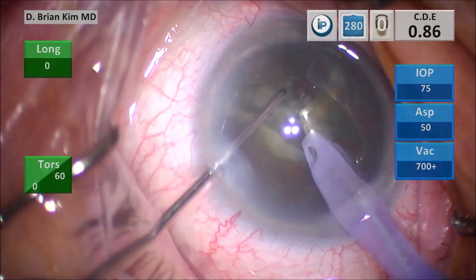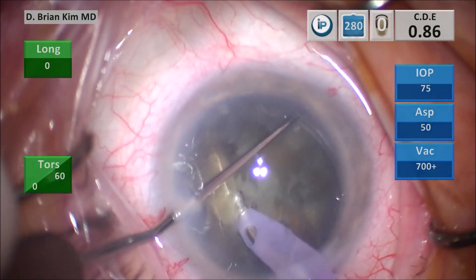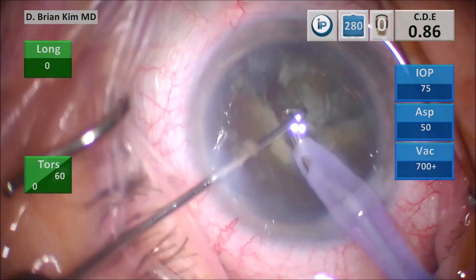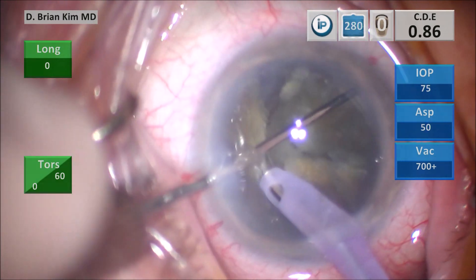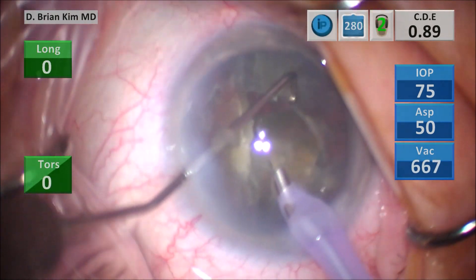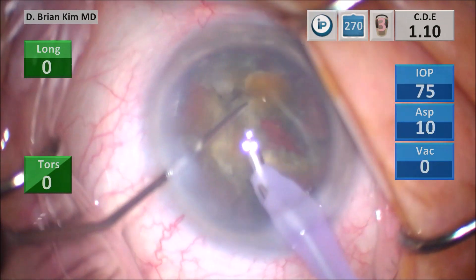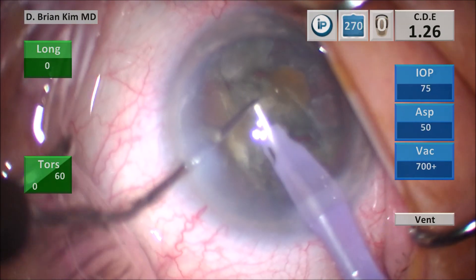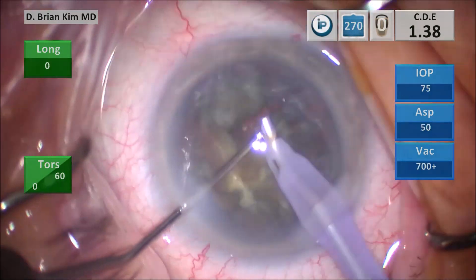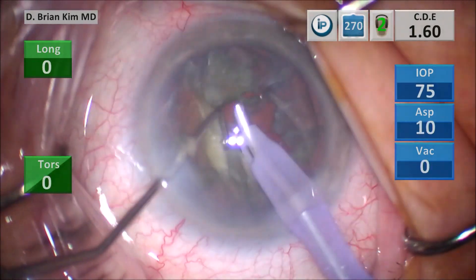I'm crushing that second quadrant in half, then place the chopper and the phacotip around that lens piece. Before doing that I'm actually doing some more separation, then I place the chopper out and sandwich that fragment between the chopper and the phacotip. I do the same maneuver again sandwiching the lens material, and once the lens pieces are small enough I'm using high vacuum to grasp and crush the lens piece into smaller pieces, then emulsifying it with pulses of ultrasonic energy. You can see I'm using the chopper to crush the lens piece against the phacotip — that's really the primary mechanism of action.